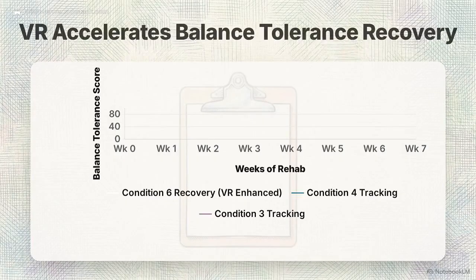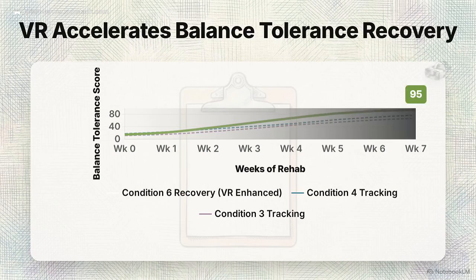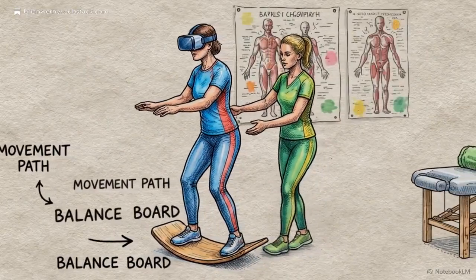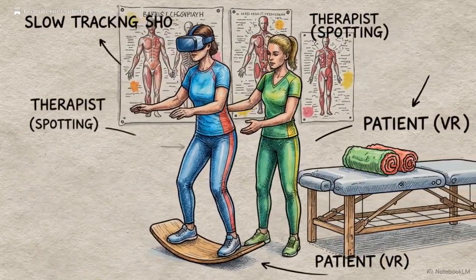Initially, a rehab patient might lose balance under low levels of visual flow. Over weeks of targeted exercise, as the intensity increases, the trend lines track their building tolerance. Clinical research shows that exposing patients to visual flow is a superior starting point for rehabilitation compared to repeatedly practicing static balance in the dark.